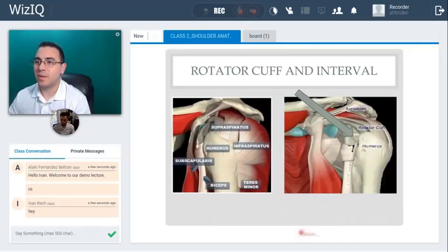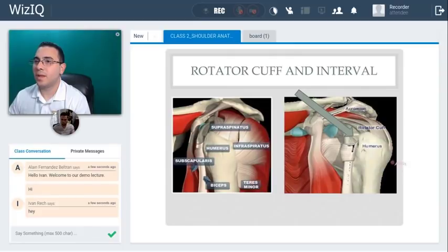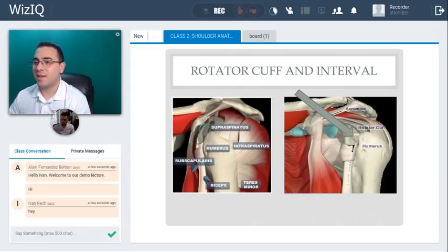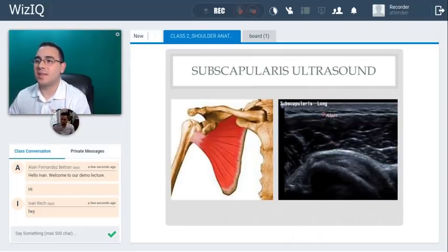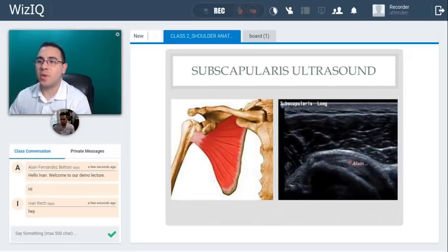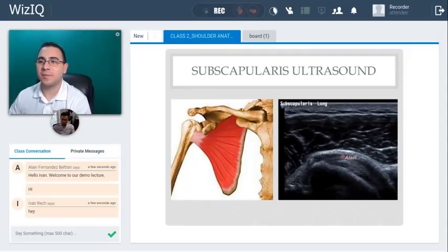Here is the rotator cuff on the humerus — the infraspinatus, supraspinatus, teres minor — and there is something called the rotator interval that we'll cover in more detail in the lectures. This is just a demo for today to give you an idea of the anatomy. Here's a nice long-axis picture of the subscapularis, which inserts at the lesser tuberosity, visible from the front.